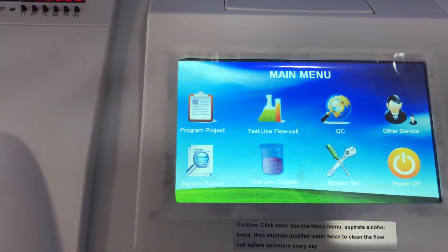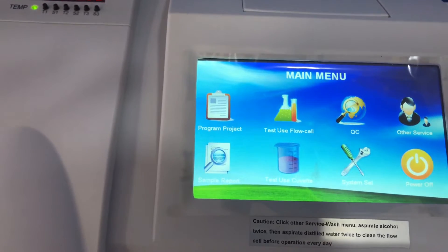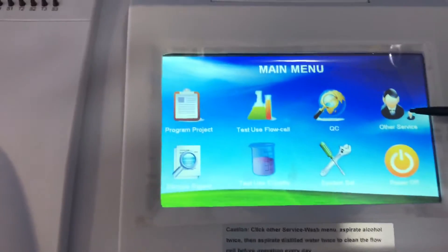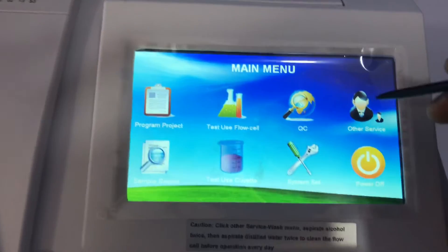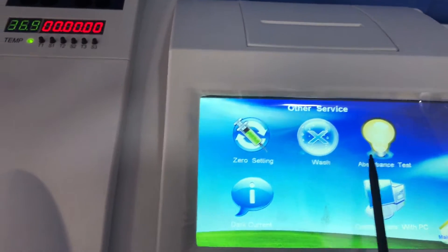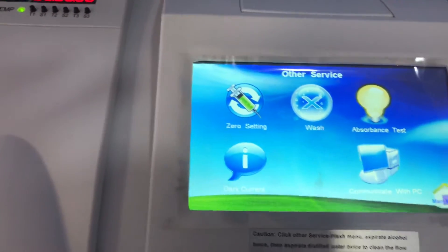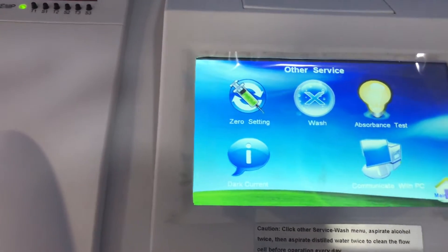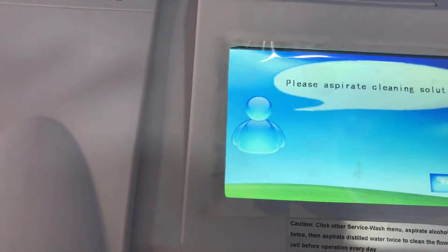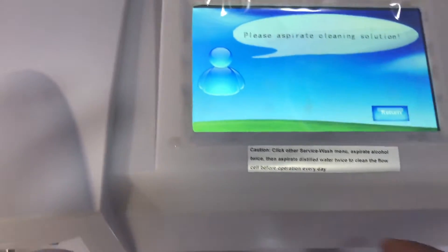The maintenance procedure is very important to make sure your results are correct and that the machine is in the right mode to perform measurements. Go to Other Services and click on it. You will see: Zero Setting, Wash, Absorbance Test, and Dark Current. You are supposed to do all of these to ensure everything is working well. The first thing I'll do is the prerequisite washing — I'll click on Wash and aspirate the cleaning solution. In this case I'm using alcohol.